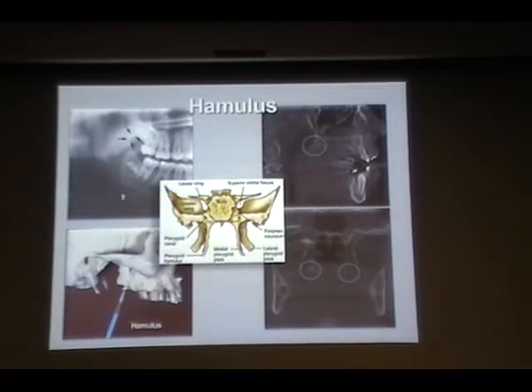Generally the sphenoid sinus will look like a single structure, but here there may be a separation. Here it is dividing the sphenoid sinus into right side and left side. Again, the sphenoid sinus generally should be air-filled, until there is some kind of pathology.